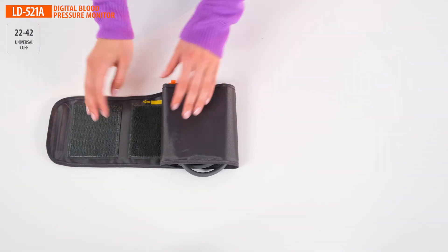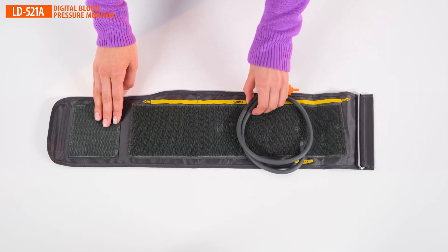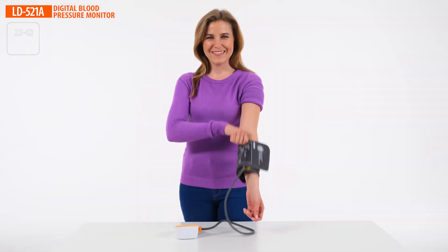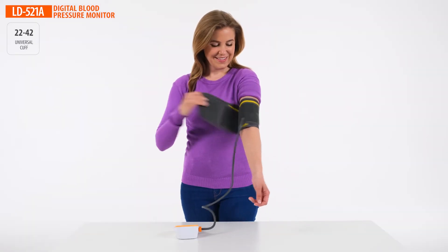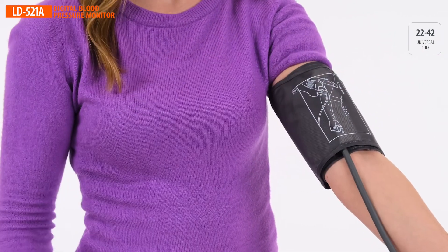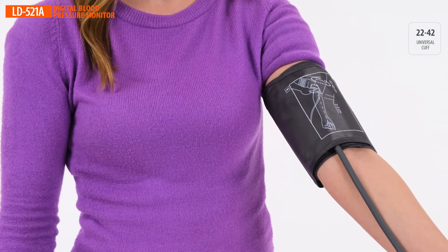The universal cuff with a metal ring is easily handled by the patient. The cuff is suitable for an arm circumference of between 22 and 42 centimeters, so it will fit every family member.